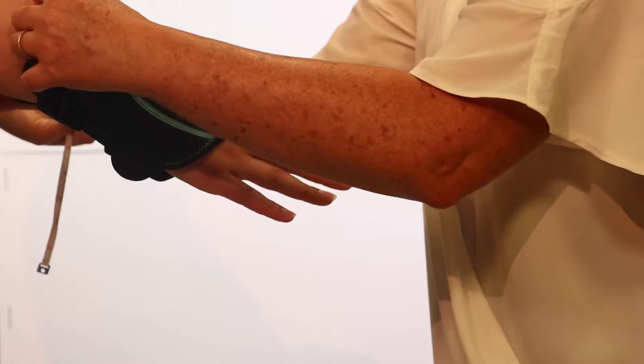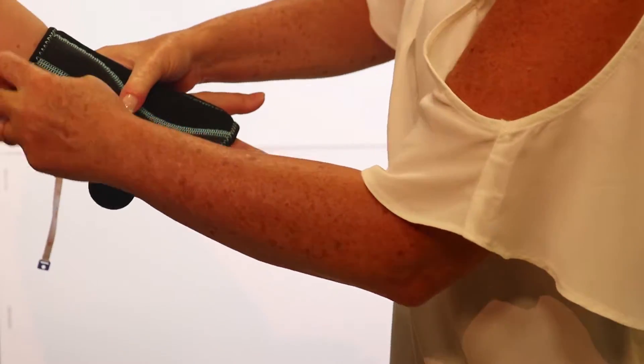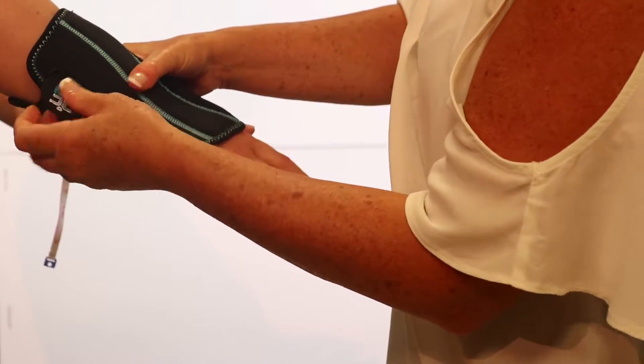To apply, slide the hand into the brace, placing the thumb in the cutout with the palm of the hand against the curved stay.